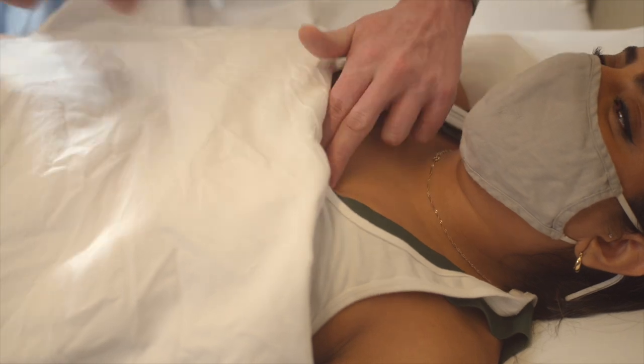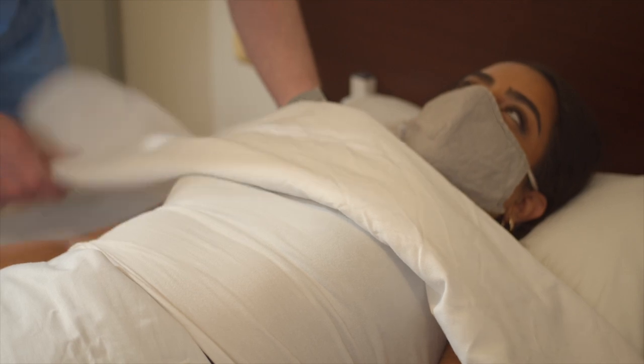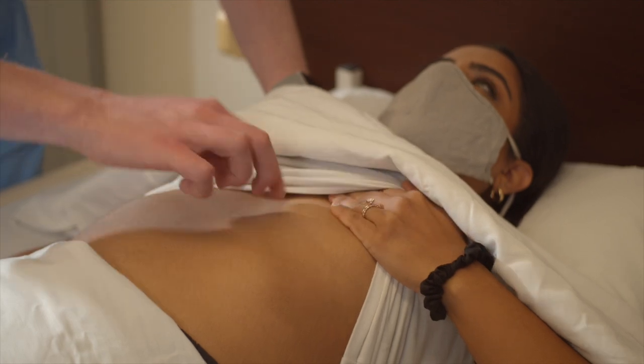Now I'm going to move the drape up. I'm going to ask you to lift your tank top for me and to pull your breast aside. I'm going to continue to landmark down.